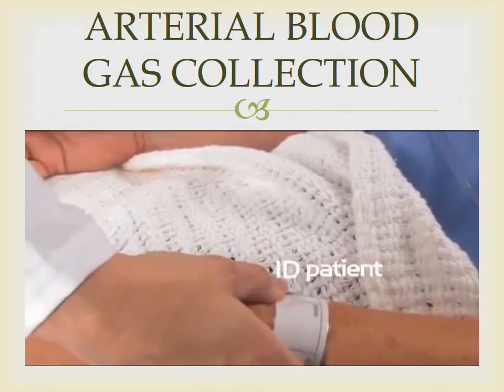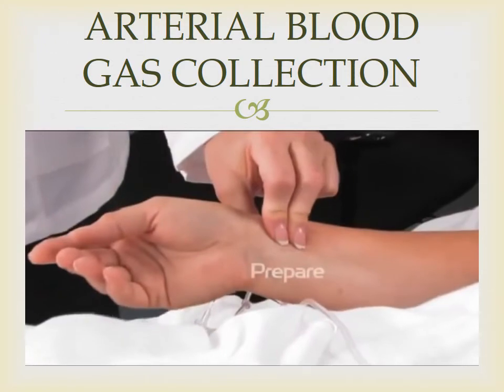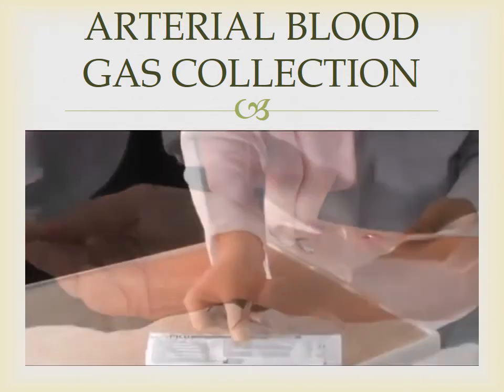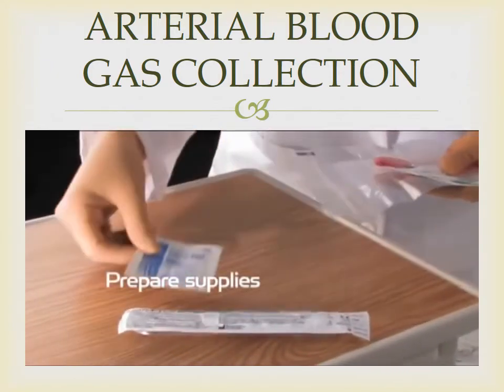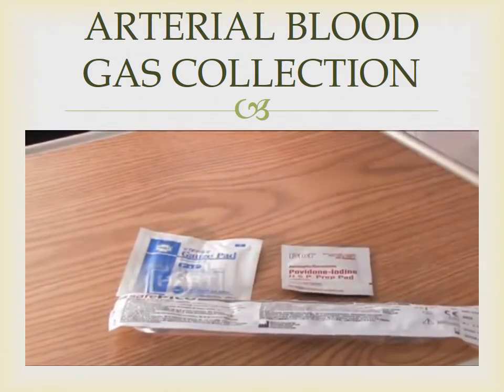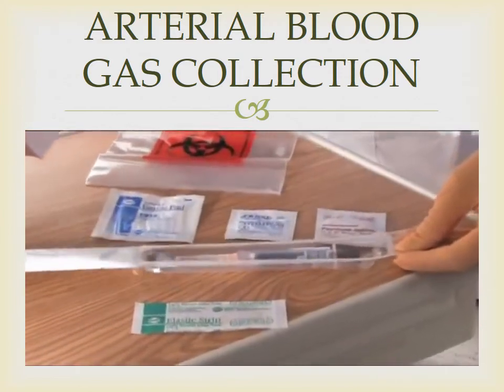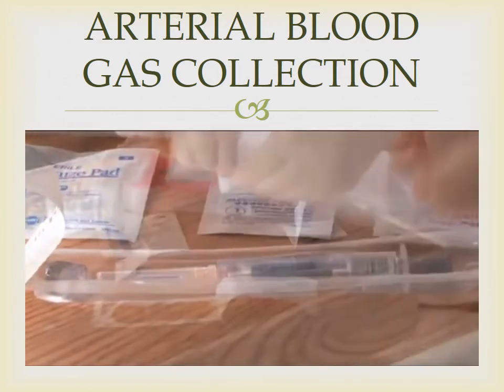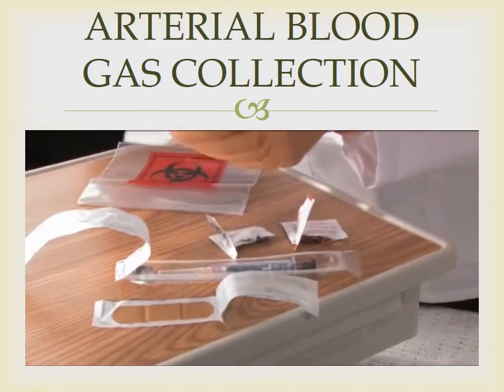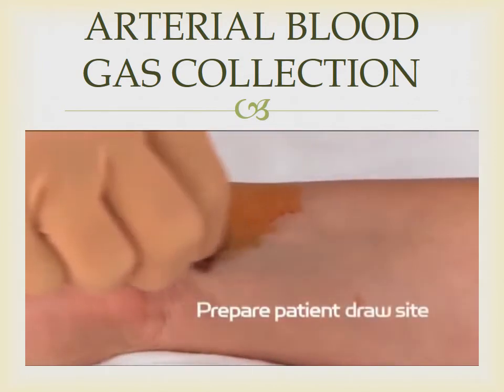Identify your patient. Prepare your patient according to your hospital's protocol, including an Allen's test. Prepare your supplies. Remove your supplies from their packaging or from the kit. Set the safe tip cap to the side, but within easy reach. Prepare your patient's draw site according to your hospital's protocol.